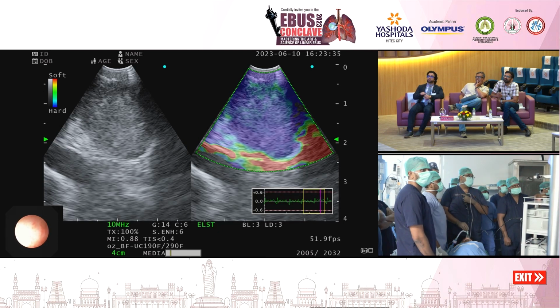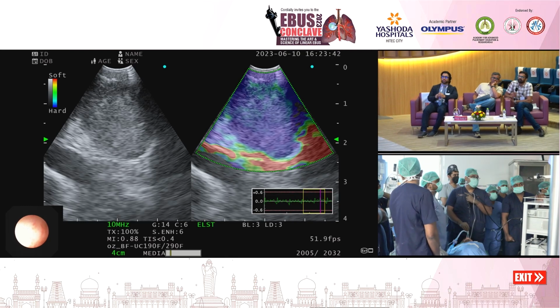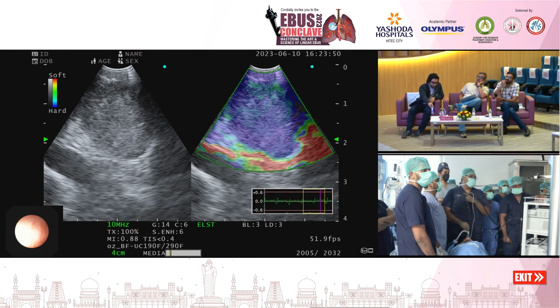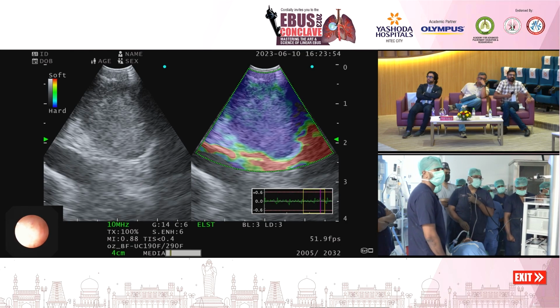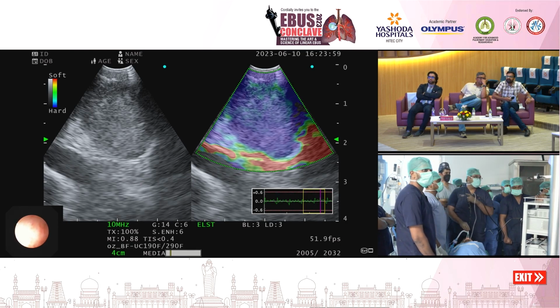So here you can see the node is predominantly blue and there are some areas of green. Elastography basically tells us about the stiffness of the node, blue being the hardest and red being the softer part. So here we can see that the node is a very hard node. Basically we said that the harder the node, the more likely it is to be malignant, abnormal. It is not a normal reactive node, it is likely to be infiltrated.